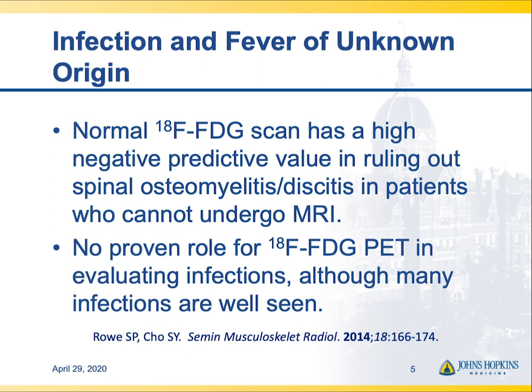If you work in a hospital-based PET practice, there will often be lots of requests for looking for infections, looking for fever of unknown origin. I would say that for the most part, there's very little in the way of proven utility of FDG-PET in identifying infection. This is evolving over time, and there are a couple of not unreasonable indications. In patients that may be relatively younger, don't have a lot of degenerative change in the spine, and don't have a lot of inflammatory disease in the spine at baseline, if they cannot undergo an MRI, FDG-PET, if it's normal and doesn't show any abnormal uptake in the spine, essentially rules out osteomyelitis discitis.